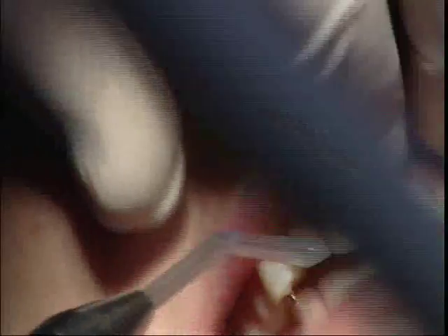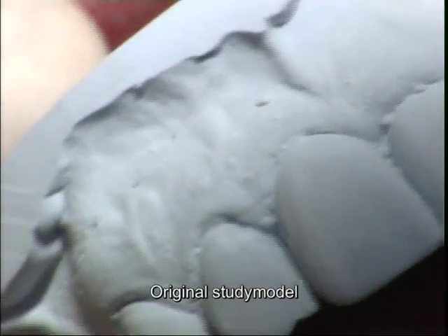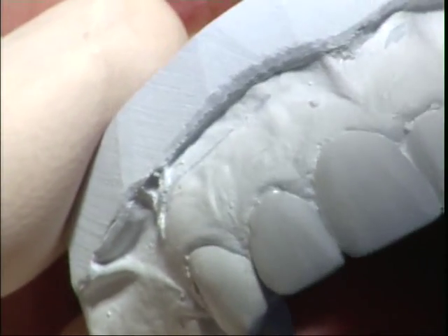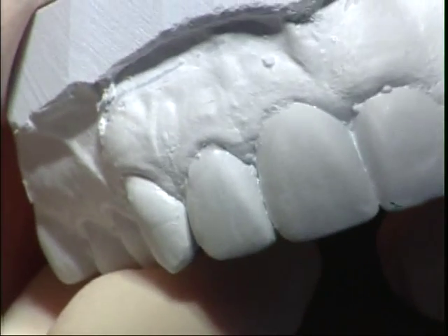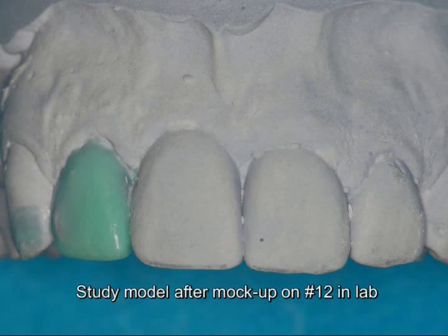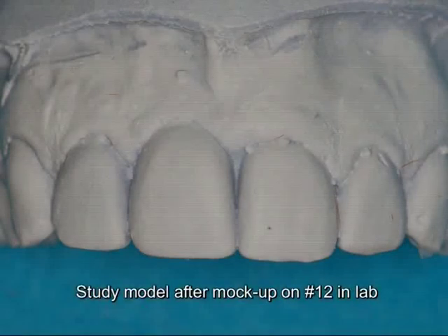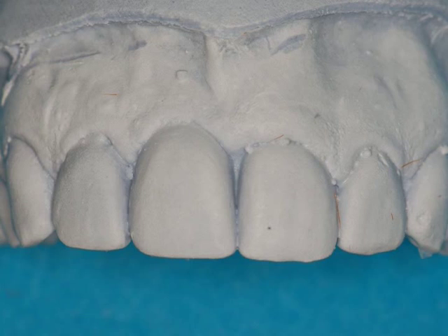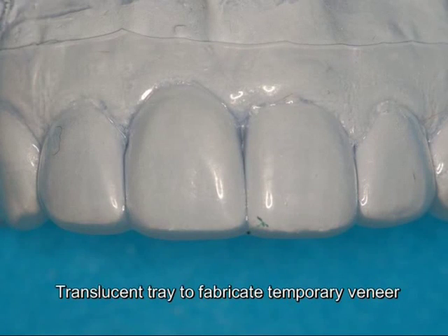We are going to do the temporary here now. For that reason we have our first study model. The tray for the temporaries is done on the study model — or on the study model changed by the lab technician — due to the anatomy that we are going to give the patient later. This is a class mock-up. This is then a duplicate of this model that the lab is producing. And this is then the tray that the lab is fabricating for the temporary veneer.